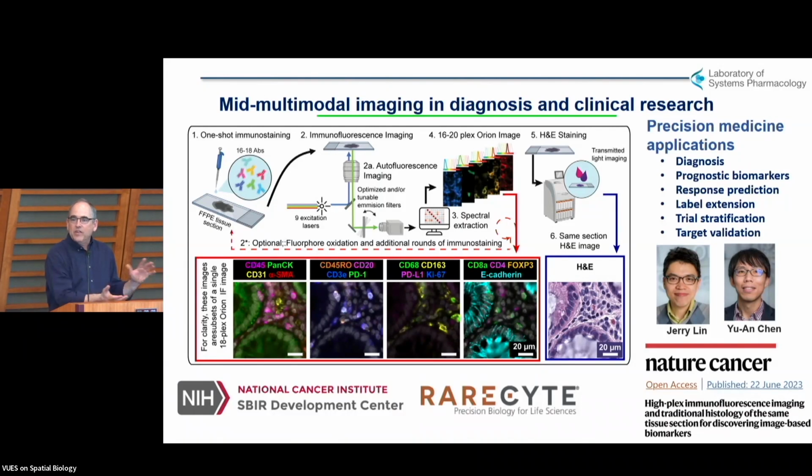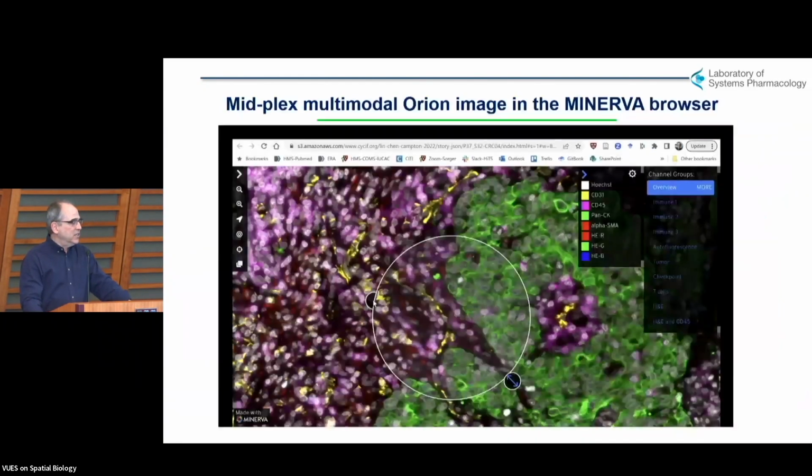And you can think of all sorts of tricks back and forth. Use the molecular data to label the H&E data, use the H&E data to segment the molecular data, et cetera. And there's been very little exploration. And I think for this community, the thing we'd be most excited about is getting that virtual H&E embedded with the molecular data and figuring out how to calculate meshes on that. I think that actually could be quite an interesting near-term win.